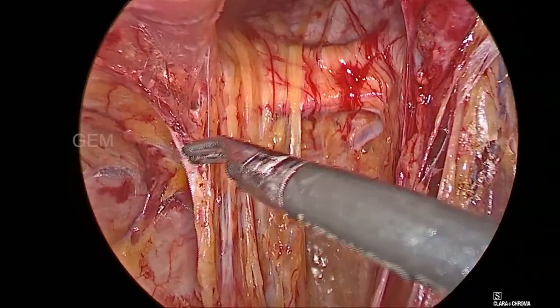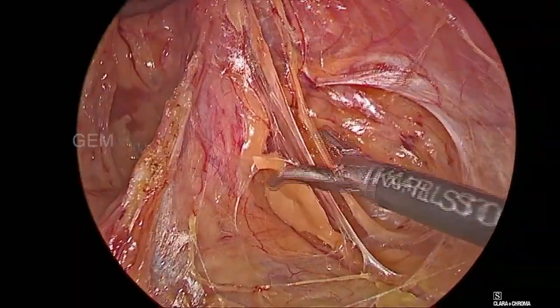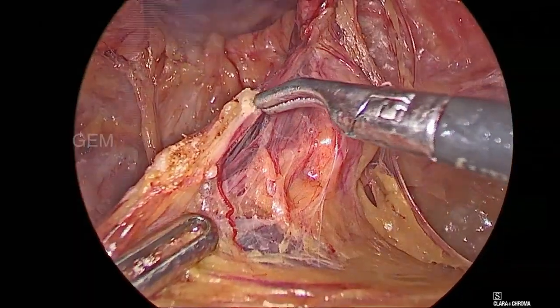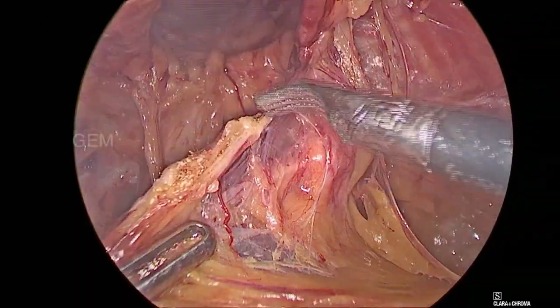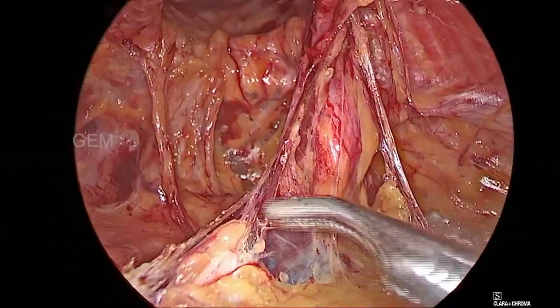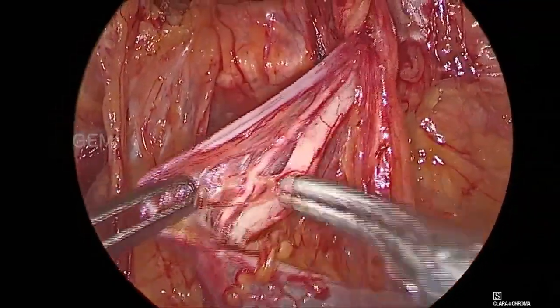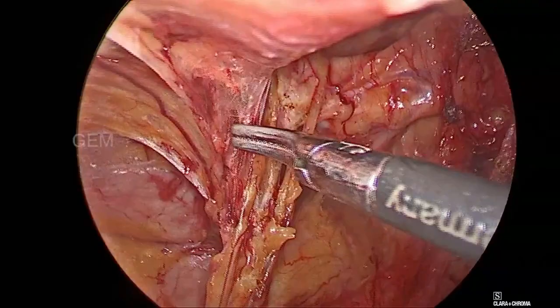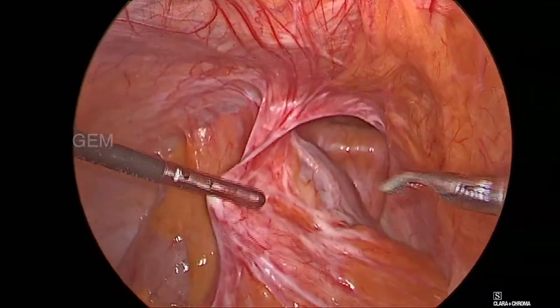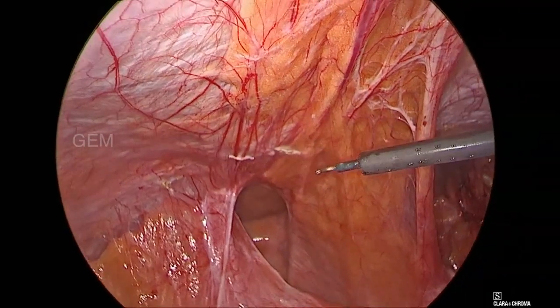Over the pubic arch, big adhesions are released and the peritoneum and bladder are pushed towards the flap. We need to prepare so that the mesh can sit down. On the left side, the sigmoid colon is adherent.